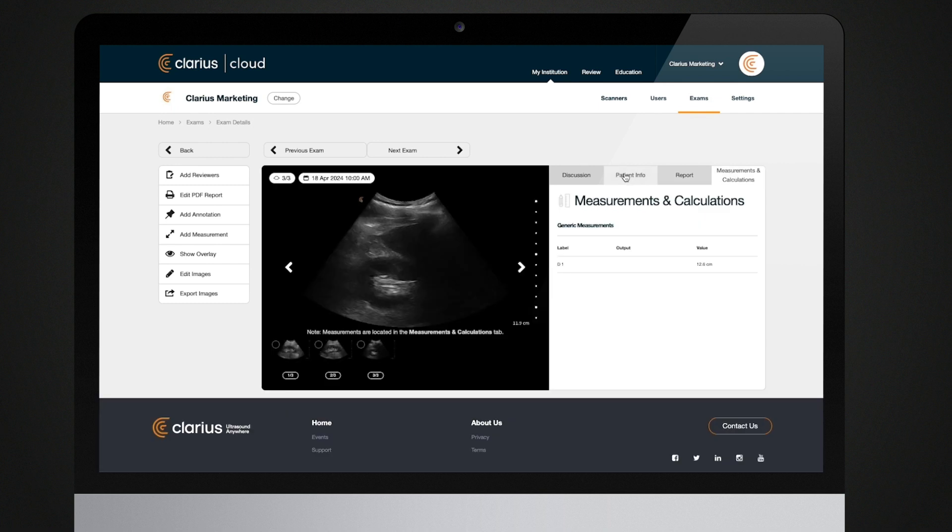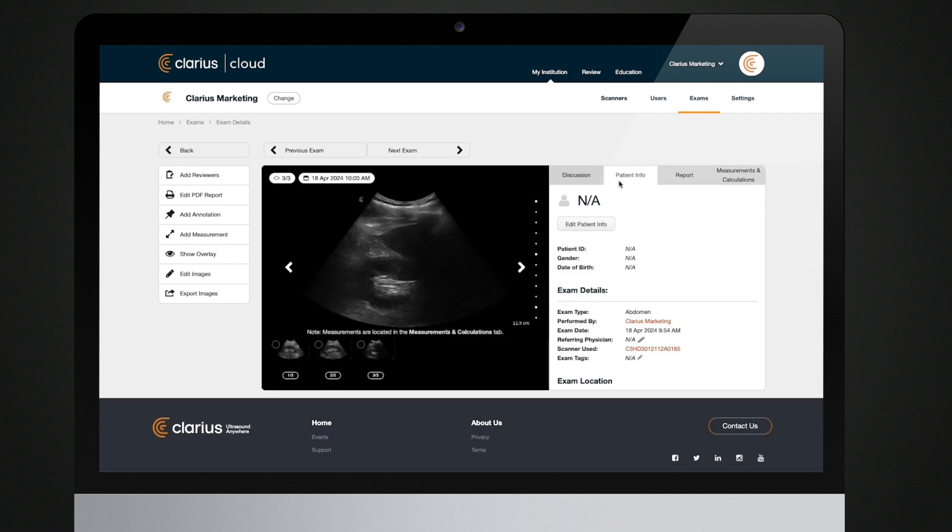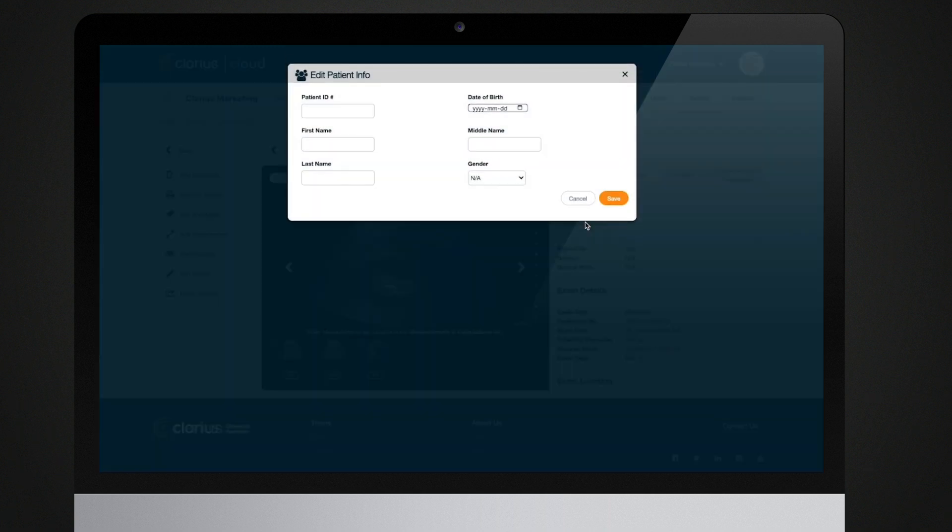If you don't fill in the patient details while using the app, you can do that now. Click on the Enter Patient ID to attach a patient to this exam.